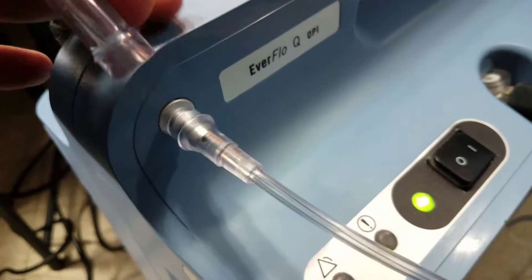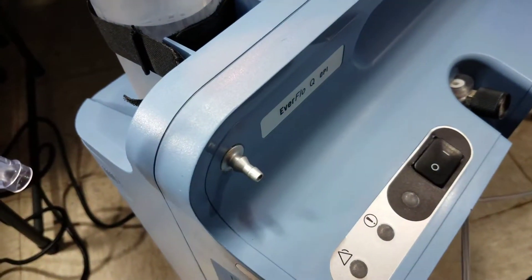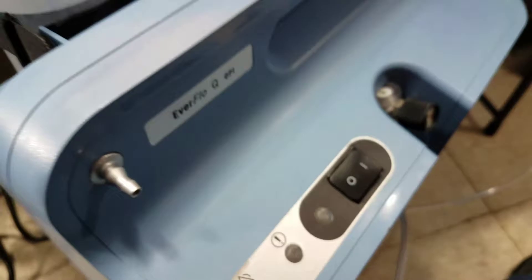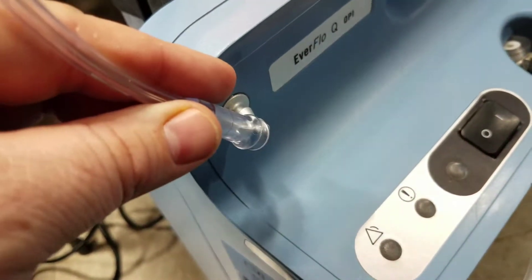Okay, so one important thing to note is make sure your concentrator's turned off before you try to do this. The little short tube that you're seeing running from the humidifier is gonna hook into the output of your oxygen concentrator. Make sure you push that on there snugly.